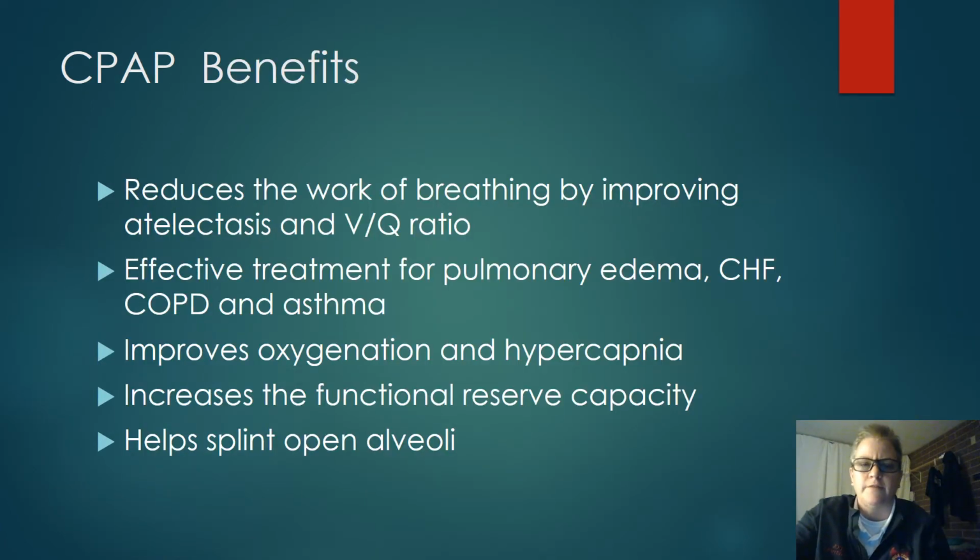Okay, we've talked about some of the benefits. Reduces that work of breathing, improves that atelectasis. It kind of helps splint or keep those alveoli open, so the VQ ratio mismatches are decreased and you get a lot more oxygenation as well as offloading of the carbon dioxide.